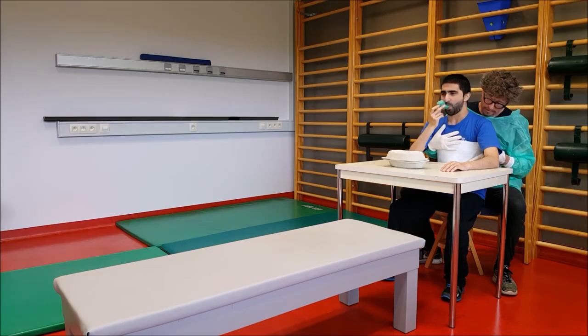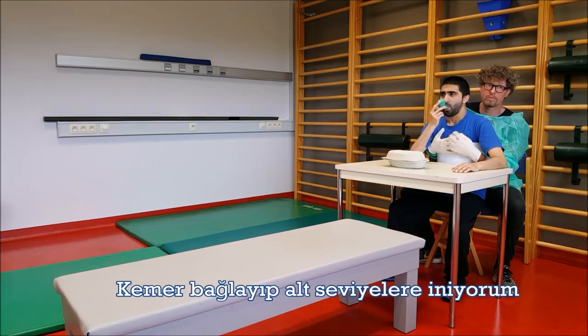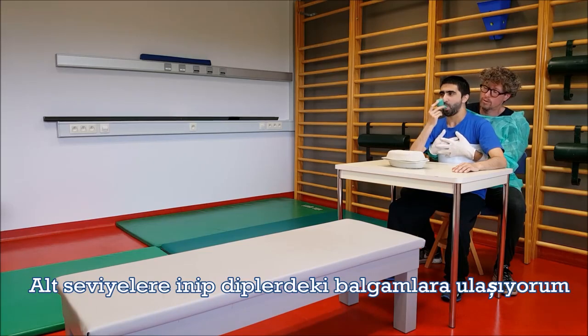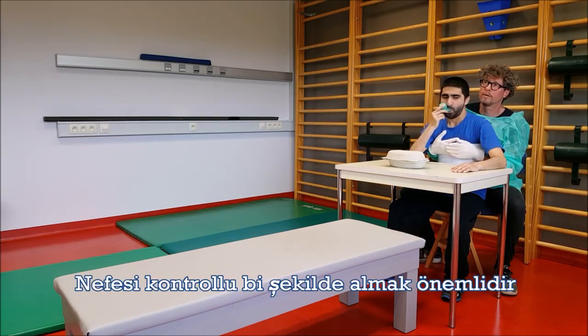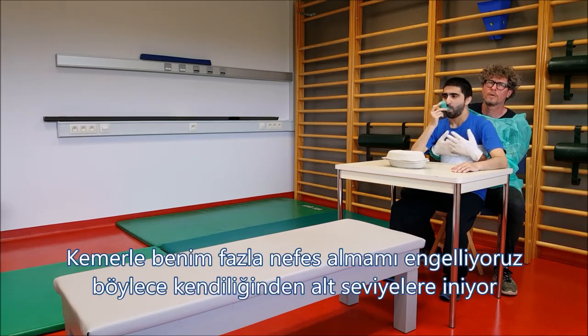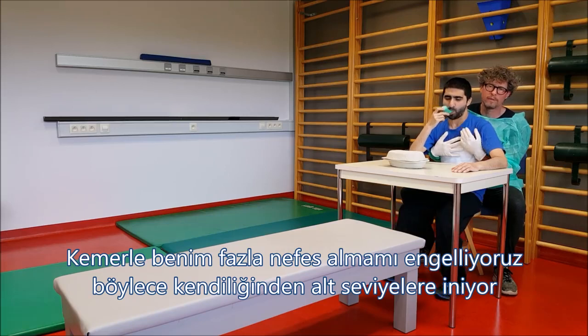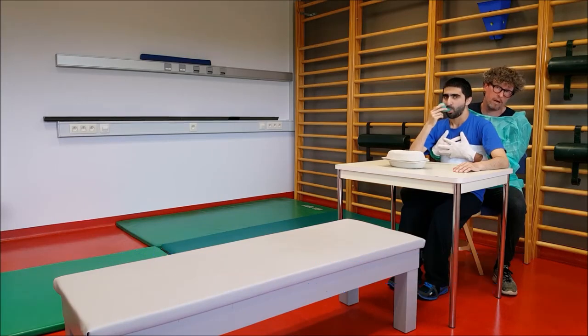You can see with Ibrahim, he's wearing an elastic, semi-elastic band. Why is he doing this? Because the whole principle of the autogenic drainage is that he has to breathe more low, less superficial. So what the band does, and what I'm also doing, is I'm kind of blocking or limiting his inspiration. That way automatically he will expire more. This is almost like a reflex.